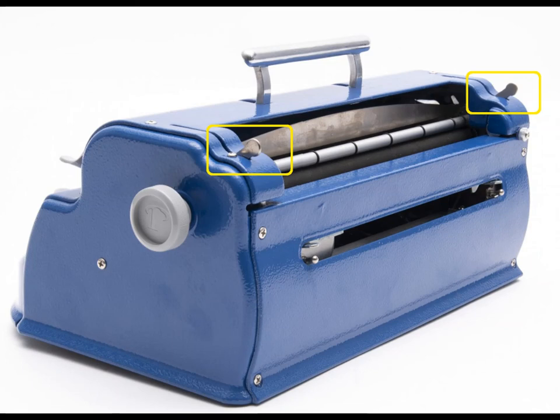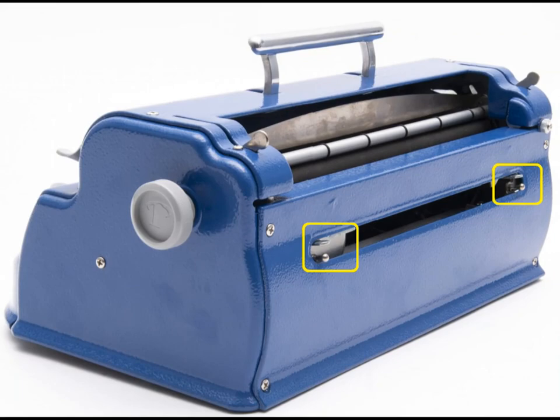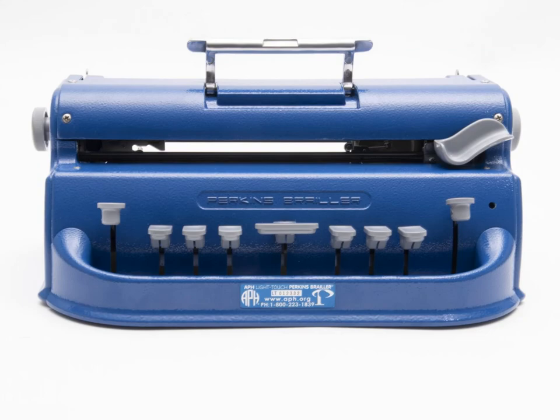The left and right margin stops are used to make the margins for the paper. They are adjustable because the paper can be inserted either vertically or horizontally, and they are moved by pinching the two metal pieces together and sliding them either left or right. When there are seven spaces left in the line, a bell will ring to let the user know that they need to move a line down.